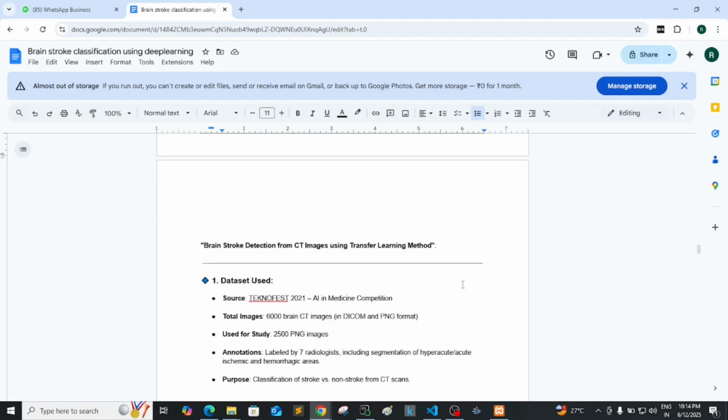So now we studied what papers are there, why we are doing this project, what is the importance of this project, and all those things. Now I will tell you what we are doing in our project, what is our proposed methodology, and why our proposed methodology is better than the existing proposed methodologies. A few points I may skip here because we can't give 100% of everything here.